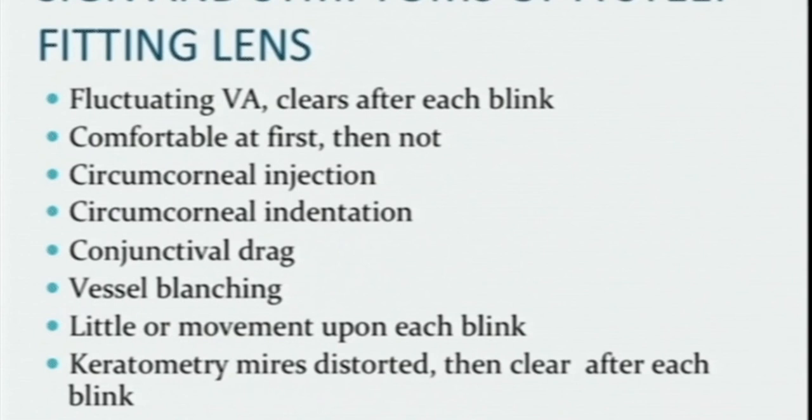Signs and symptoms of a steep fitting lens: fluctuating visual acuity which clears after each blink. Then you'll have to correct accordingly, which I will mention later.